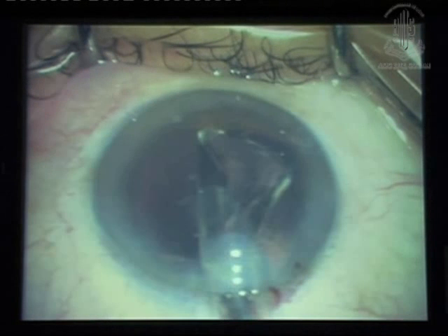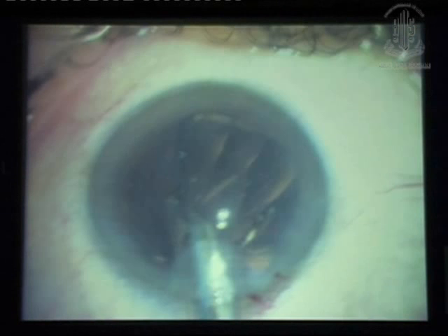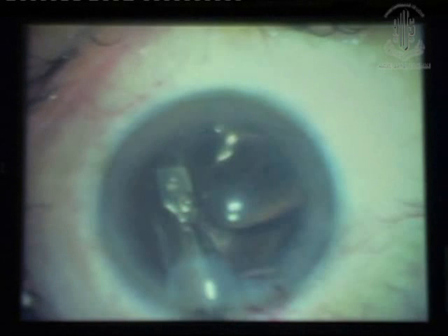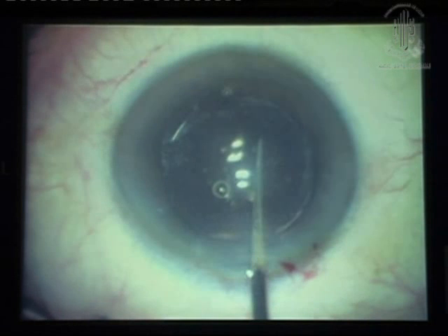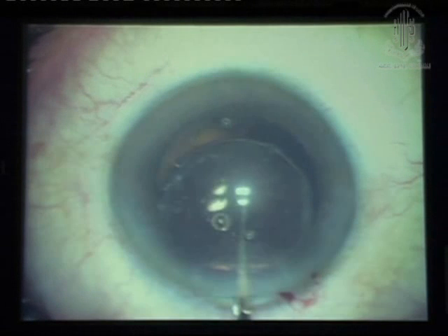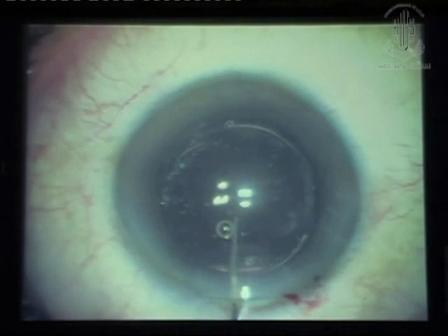You have an intact anterior capsular rhexis, there's nothing to worry. This lens is not going to drop anywhere, and definitely if you have an intact anterior capsular rhexis, we must do rhexis capture of the optic. That would just ensure centration.